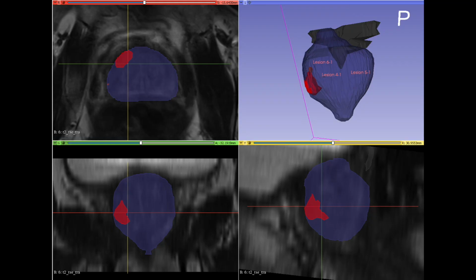It would be great if a patient could have an MRI and then very rapidly, within an hour, let's say, of their scan, I've got a roadmap of where there are any areas of concern, and I can then, for my fusion biopsies, marry those MRI images with the ultrasound images I have in real time when I'm doing those biopsies. So anything that improves efficiency there, I think has to be a positive thing.